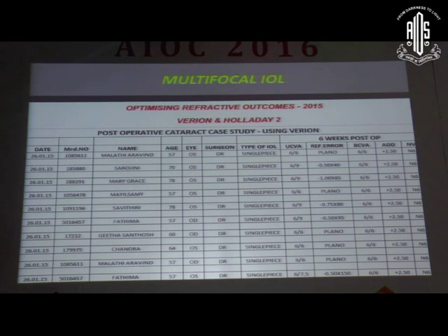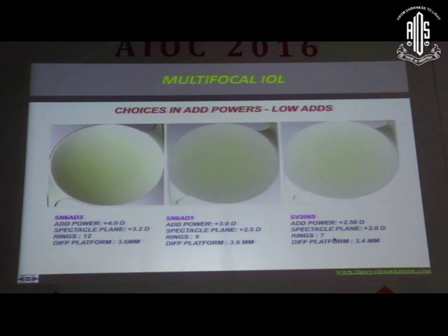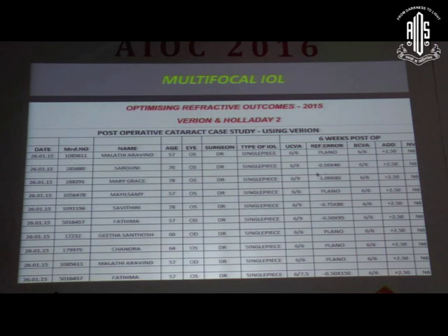Look at these results now that I'm concentrating much more on this. In the year 2015, you can see almost all of them are plano, except for some residual astigmatism. Of course, here it's -1 diopter. I think today we owe it to our patients and ourselves to achieve within 0.5 diopters of residual spherical error and about 0.75 to 1 diopter of residual cylinder error. Of course, if because of cost constraints the patient cannot afford a toric intraocular lens and there's significant toricity on the cornea, there might be some cylinder that you and the patient have to live with.